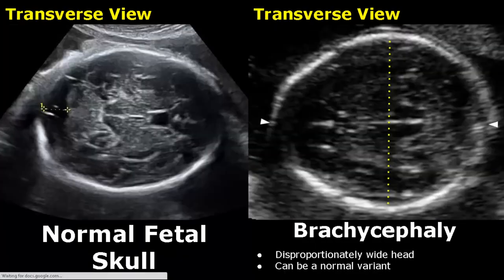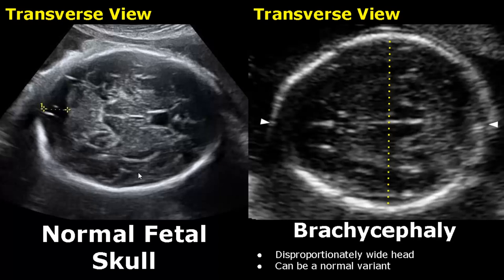Brachycephaly is a disproportionately wide head — the head is wider than usual, and this diameter is increased. It can be a normal variant or may be associated with some skeletal dysplasia.